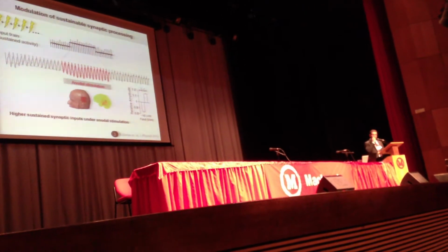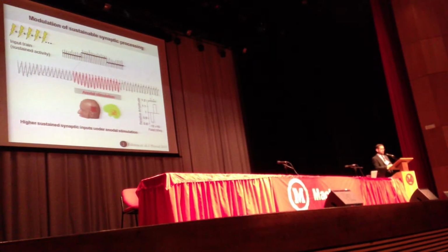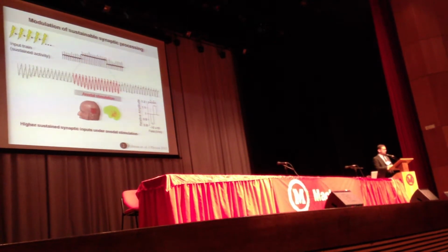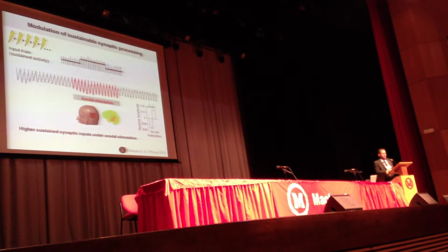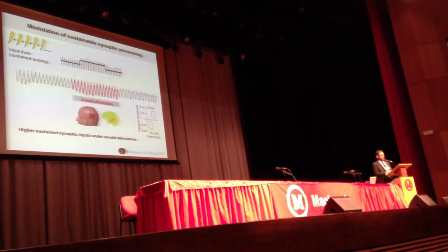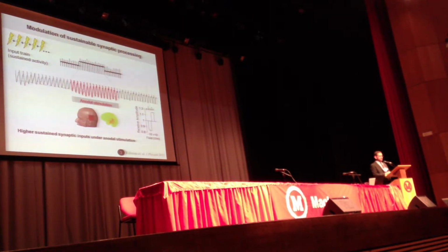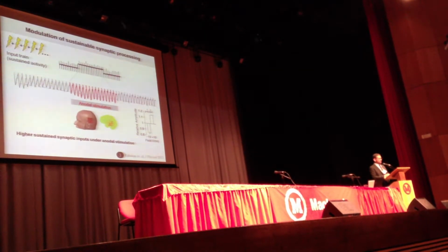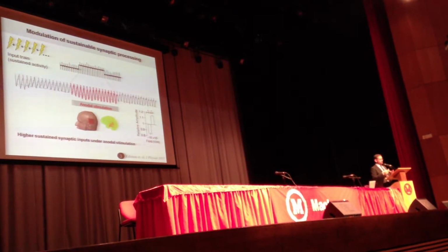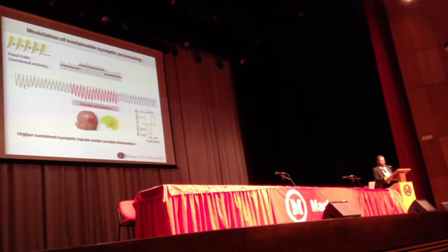And the reason I think this is very translationally relevant is often tDCS is not applied on its own. It's often applied in conjunction with something. So tDCS in conjunction with reading, tDCS in conjunction with various forms of rehab. And what you're trying to do is you're trying to make that process more effective, right? You're trying to make the reading accelerated. You're trying to make the rehab accelerated. And so you can very generally think of an analogy here where when you, for example, apply DC anodal stimulation to the cortex, it's not that you're making it fire more.